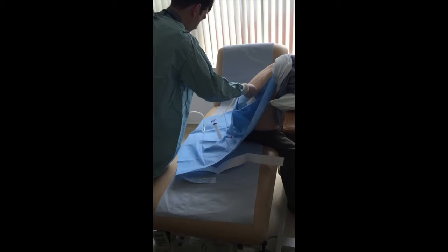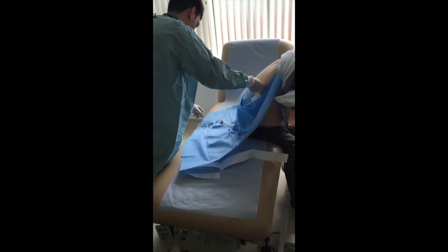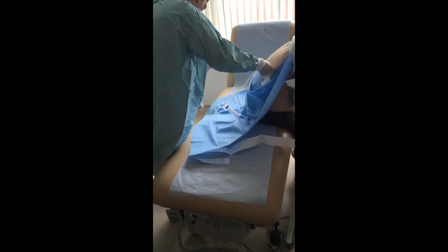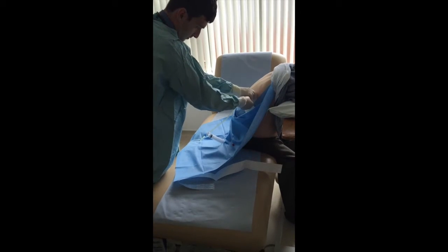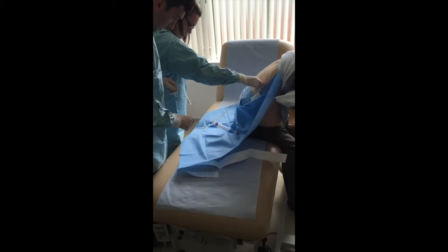And if I put this down on the sterile towel on the bottom here, just to keep everything nice and super clean, then what you can do is just let gravity do all of the work to drain that for you. Okay. Now, if you're not getting a great flow, you can start moving this around. As you pull it out slightly, you get an increased flow here. I've just pulled the cannula back slightly, but what you can see is your flow starting to increase here now.